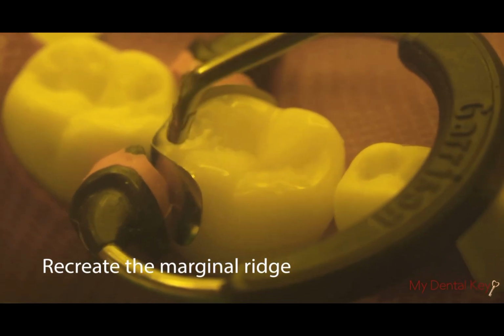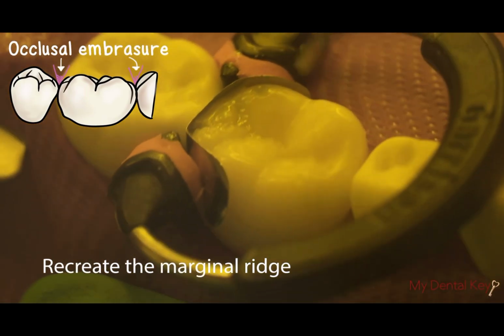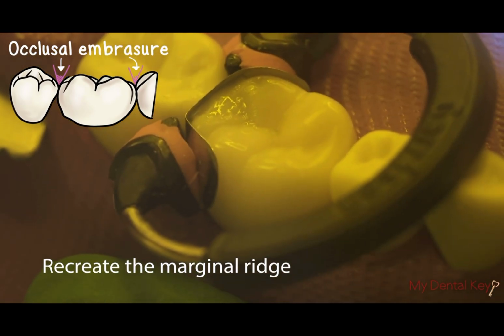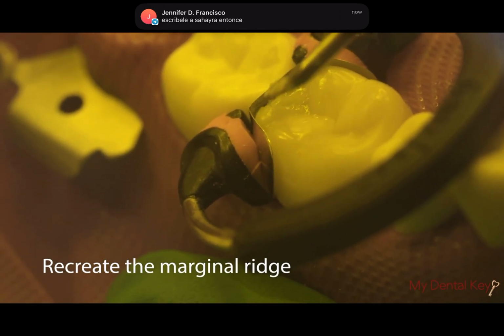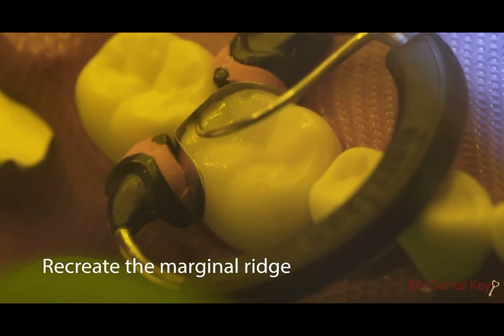Now, apply and condense composite to create the marginal ridge. When doing so, match the contour and height of the marginal ridge to that of the adjacent tooth. Use the tip of your explorer or hand instrument to round the marginal ridge and recreate the contour of the occlusal embrasure. Carefully recreating the anatomy at this step in the procedure can save a lot of time later on during the finishing and polishing steps. Light cure the composite for 20 to 40 seconds.